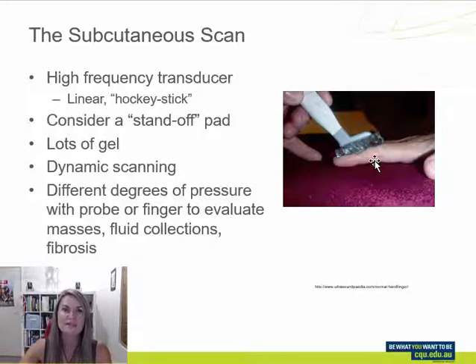Make sure you're also scanning well past any joints to check for any migrating foreign bodies, or there could have been a piece of glass or something that had some shards break off. So you could be looking for multiple foreign bodies rather than just one. You need to be very thorough and systematic in what you are doing.